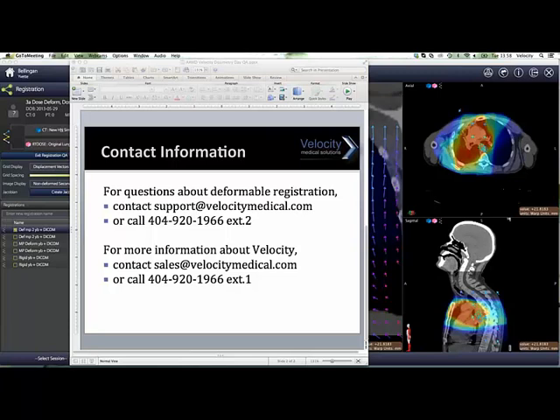Two other really good questions coming in, guys. Is this type of treatment planning system in widespread use in the United States? And I would say yes. In the past, really 2 years, I've seen it take off very rapidly with sites acquiring deformable image registration.